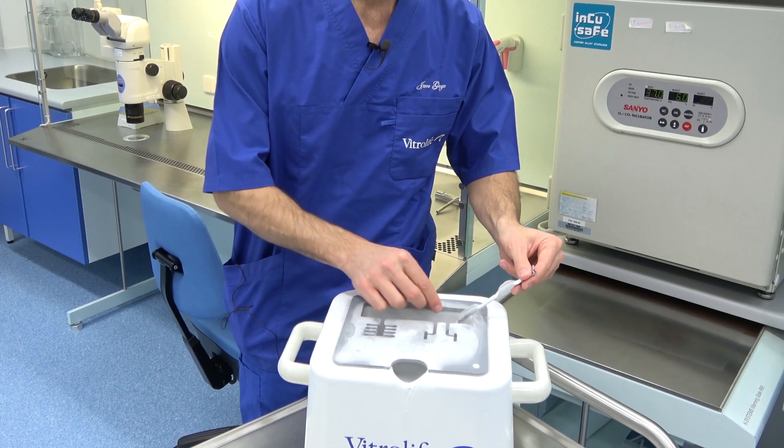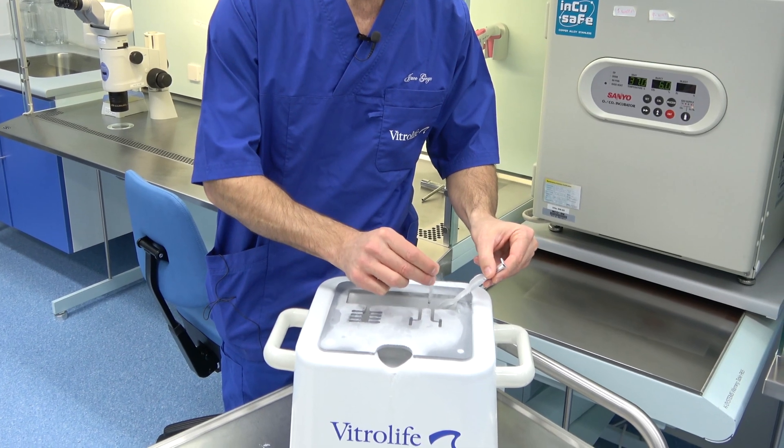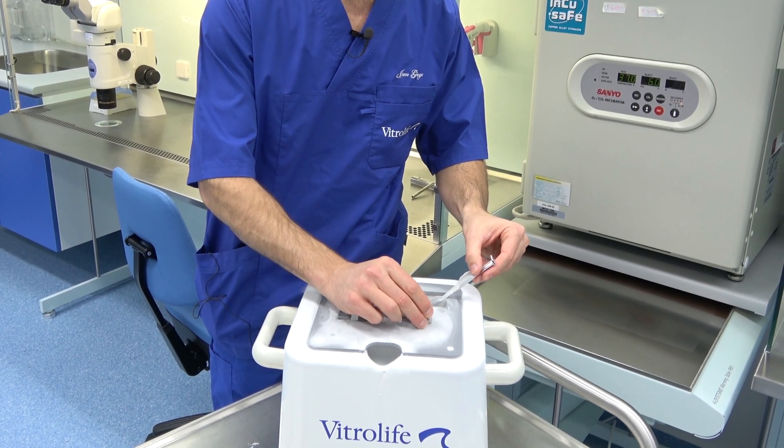Once you have identified the correct straw for the patient for warming, place the cryocane with the Rapid straw into the smart box. Very carefully remove the Rapid straw and place it in the slot of the lid where the magnet is. Make sure that the Rapid straw never leaves the liquid nitrogen. The bottom black mark should always be submerged under the liquid nitrogen.